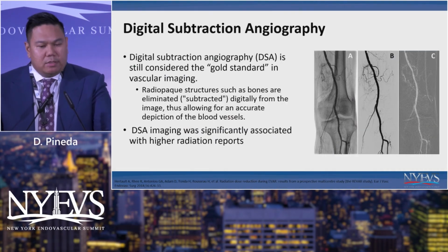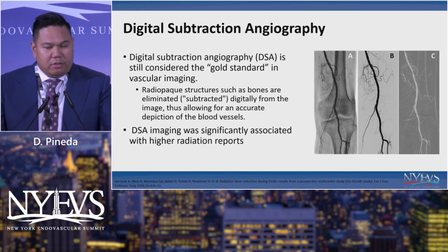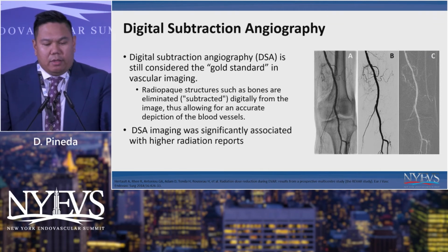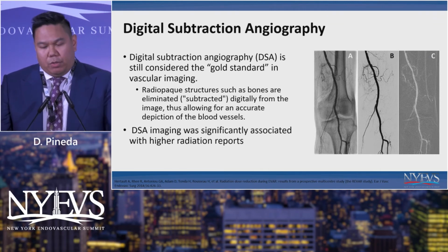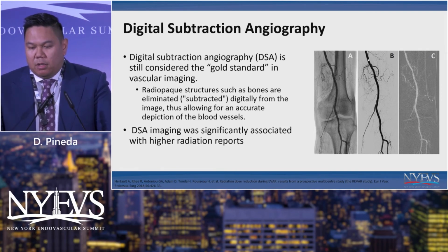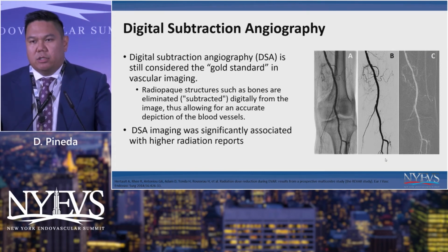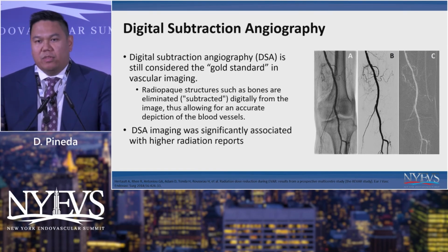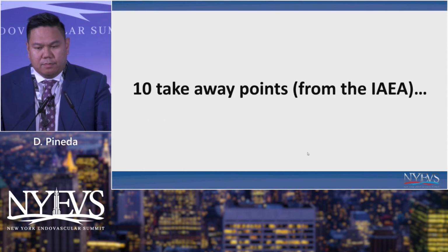In the endovascular space, doing endovascular interventions and angiography, we all know that digital subtraction angiography is the gold standard. That's how we're able to visualize the arteries very well. DSA works by taking an acquisition of the artery of the leg, and then the computer digitally subtracts out the bone, so you can just focus on the artery. This methodology is very similar to Cine, uses more radiation, but in the hands of trained, experienced interventionalists, it may improve the efficiency in doing procedures.